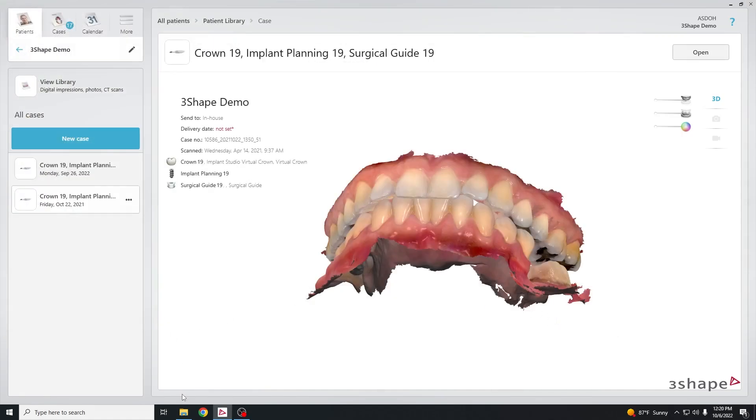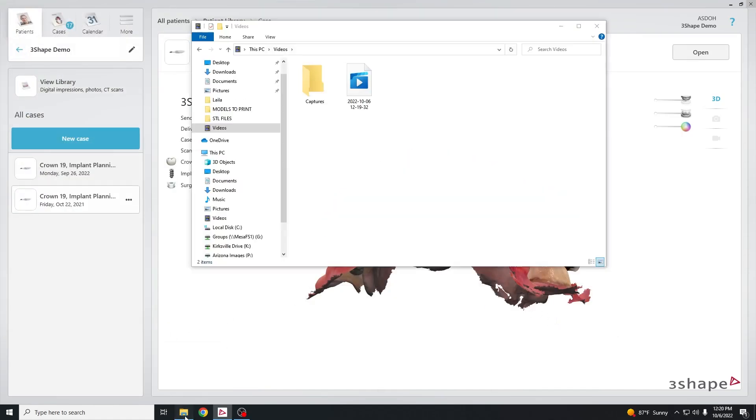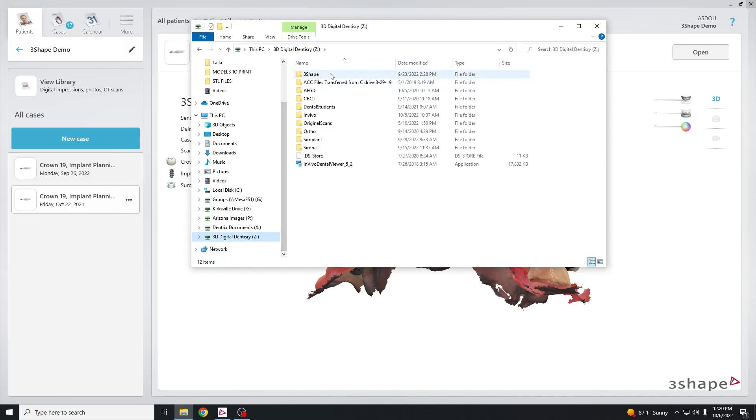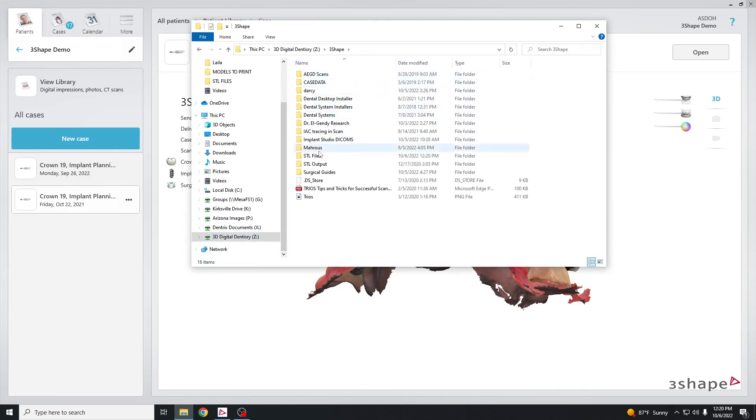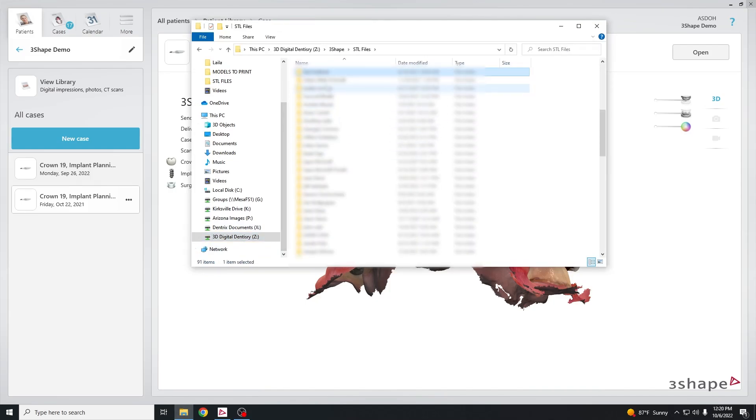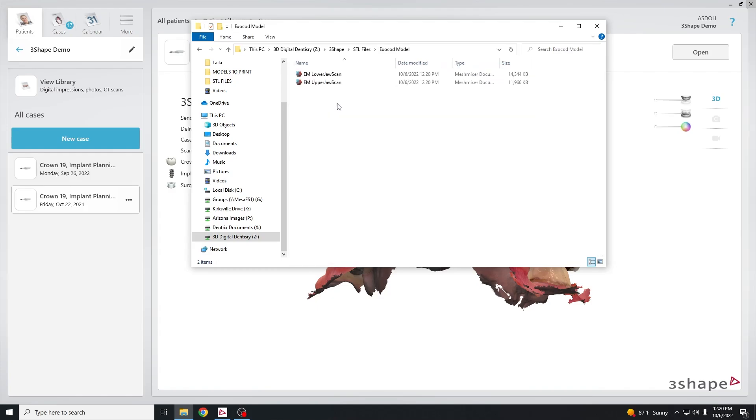Go back to the Z drive and check that the files are there. Go to STL files, Exocad model, and you'll see the upper and lower scans saved to this folder.